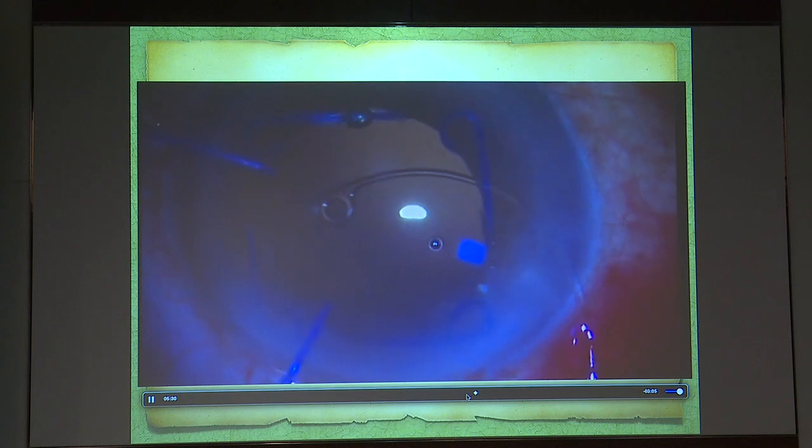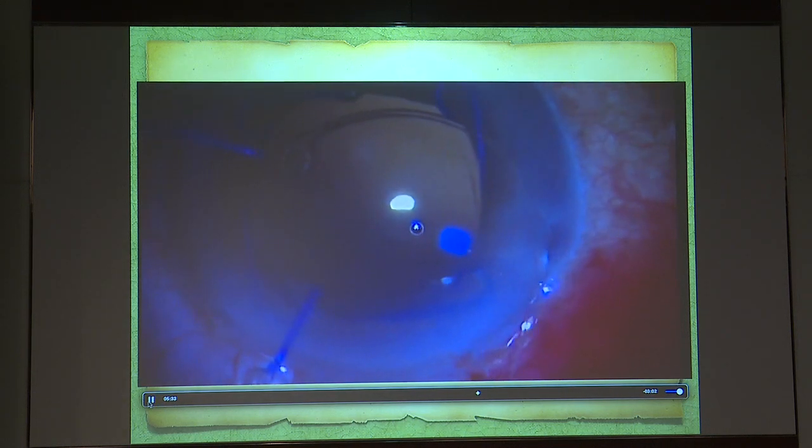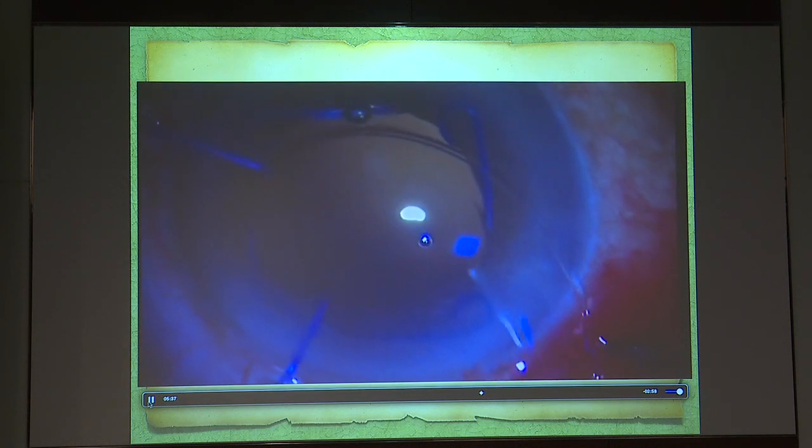So if you had capsular hooks here instead of iris hooks, one more thing we have to remember, that the capsular hooks have to be made a little loose before we put the endocapsular ring. If that's not done, again there will be entanglement there at that level. Luckily I had iris hooks, it's not reaching the equator of the lens at all, so that is quite safe. But if I had capsular hooks, I normally loosen them a little bit and then I put the endocapsular ring.